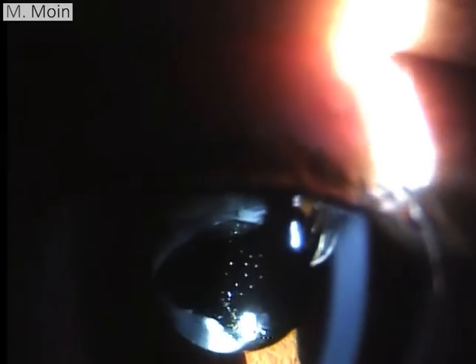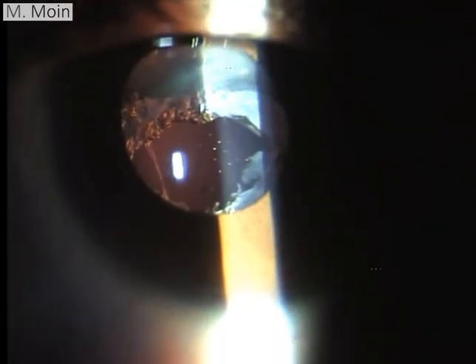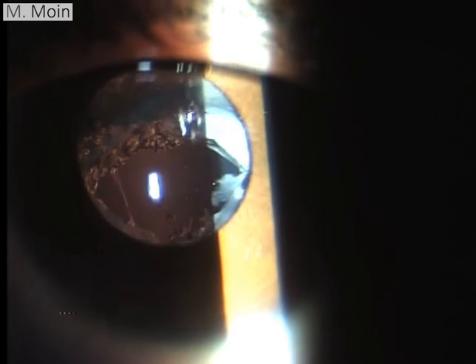So we move forward. You can see the slit beam in the anterior chamber and we're doing a retroillumination of the lens to see the posterior capsule thickening in the area. But because the pupil when it's constricted is not going to come in the way of his visual axis, it's probably this amount of posterior capsulotomy might be adequate for the patient. But sometime with this kind of thickness it is better to go in and incise this posterior capsule thickening using a needle.